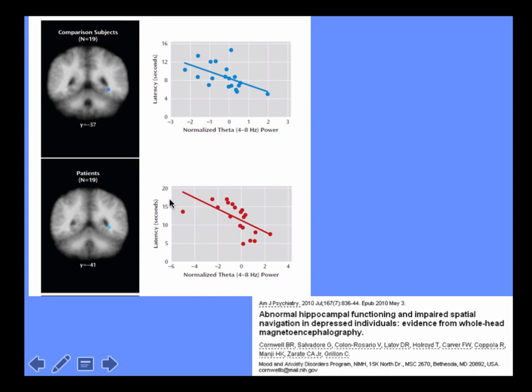We've also been able to do this, from some very early work by Brian Cornwell, because people really didn't believe that you can see these cortical surface things with MEG, but can you see deeper structures? For the most part, people didn't believe that, mostly because the other MEG machines out there were not quite as good as our 275 channel machine in terms of the noise immunity you need to get the signal to noise ratio for seeing deeper structures.